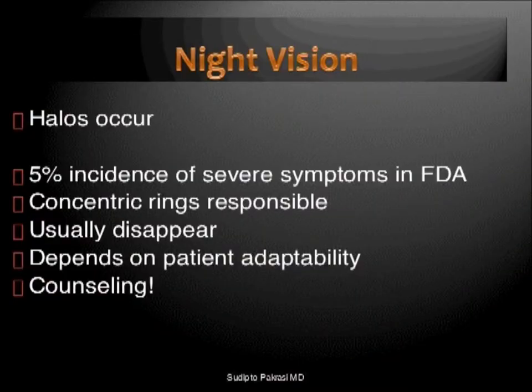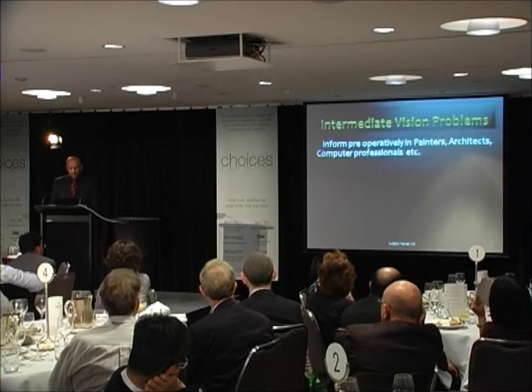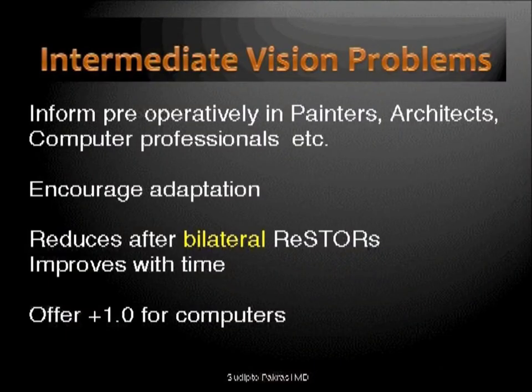Night vision, halos do occur, rings do occur, and these are things which we need to appreciate and admit it does happen, but in most people it disappears. I've had 3 people who are still cribbing about rings out of more than 300 cases we have done. They're cribbing about the rings. It does happen. Intermediate vision problem is an issue after unilateral Restore. Most of the cases after bilateral Restores have become much better.